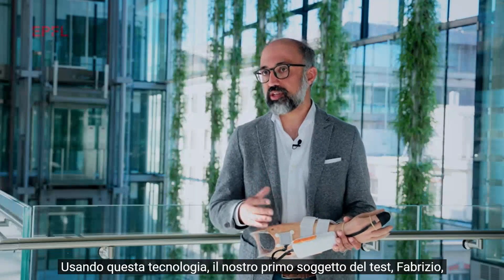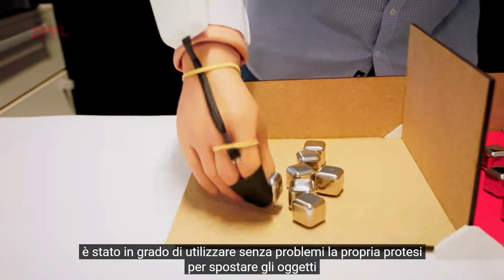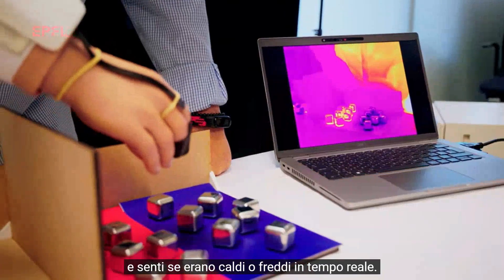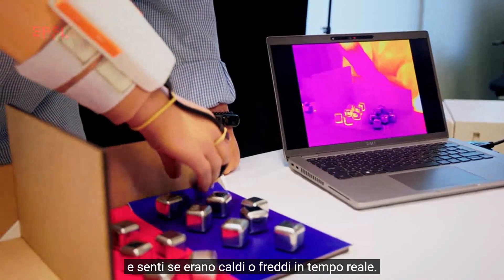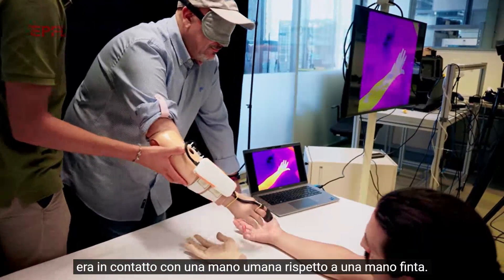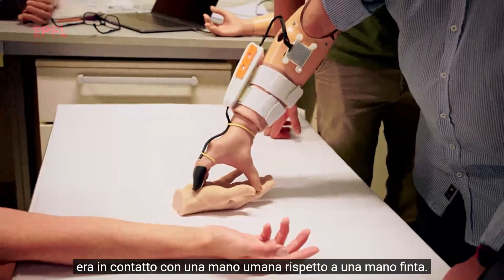Using this technology, our first test subject, Fabrizio, could seamlessly use his own prosthetic to move objects around and feel if they were hot or cold in real time. Furthermore, and maybe even more important, he could detect when his prosthetic hand was in contact with a human hand versus a fake hand.